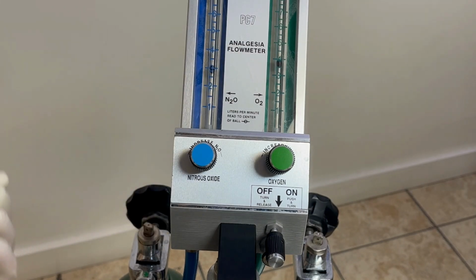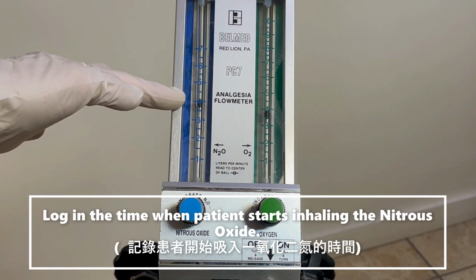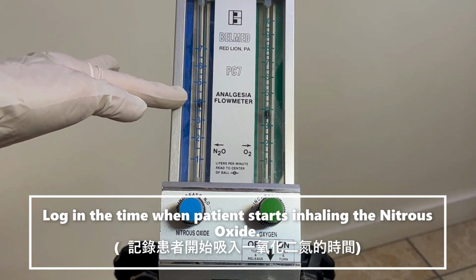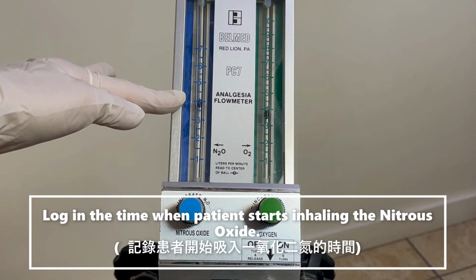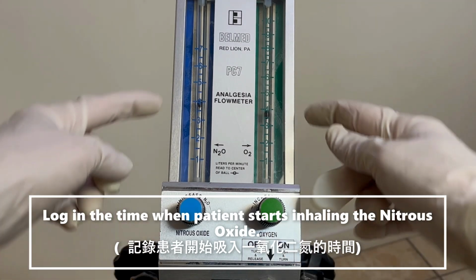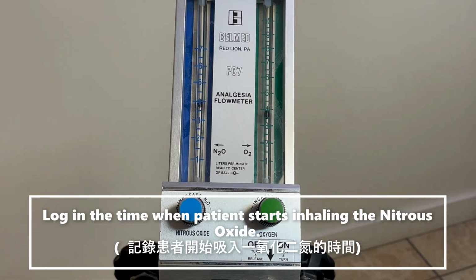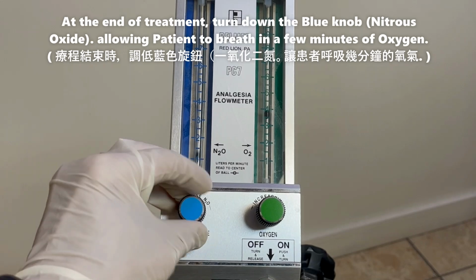That's all you need. Make sure you write down the time that you start the procedures. Log it, write it down on a piece of paper, the time that you hook it up or the time you allow the patient to breathe the nitrous oxide. So at the end of the treatment, when we turn this down, you're also going to write down how much time you used it for the patient. So I'm going to turn this down. When you're done, you can turn this down.